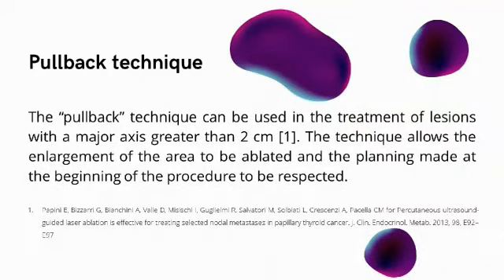The pullback technique is used in the treatment of lesions with a major axis greater than 2 cm. The technique allows the enlargement of the ablated area. The pullback technique allows the guide needle and the optical fibre to be retracted by 0.5 centimetres, 1 centimetre or 1.5 centimetres and to proceed with a second illumination of the fibre.